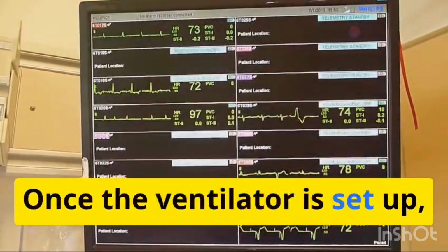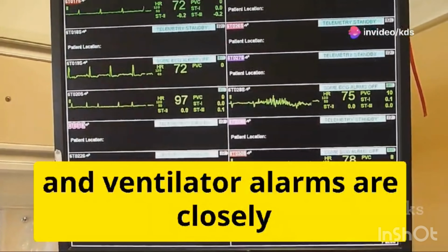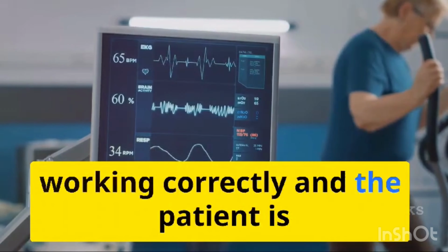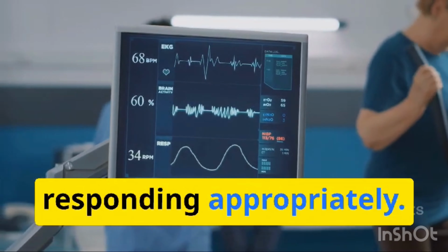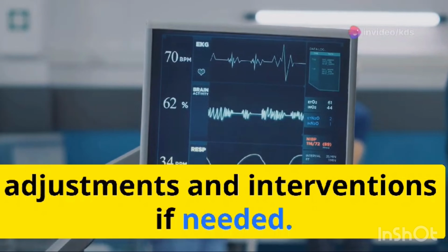Once the ventilator is set up, the patient's vital signs, oxygen levels, and ventilator alarms are closely monitored to ensure the ventilator is working correctly and the patient is responding appropriately. Continuous monitoring allows for timely adjustments and interventions if needed.